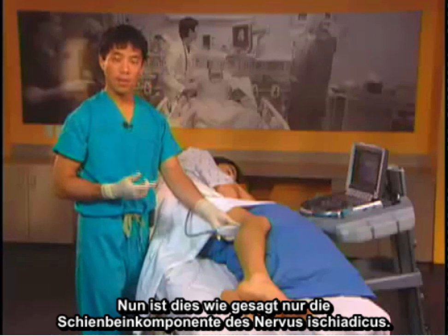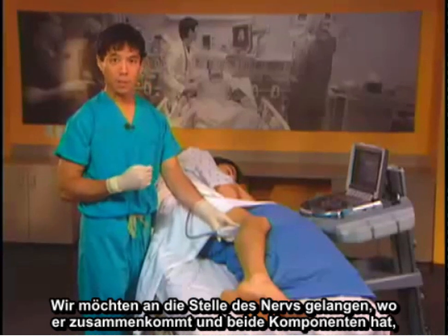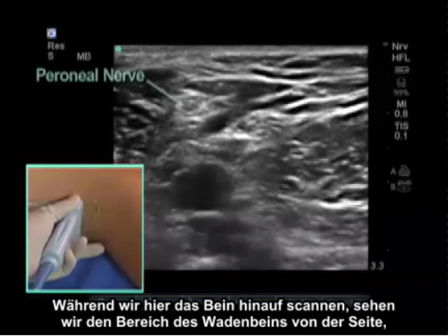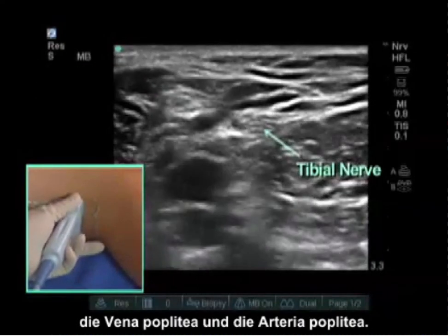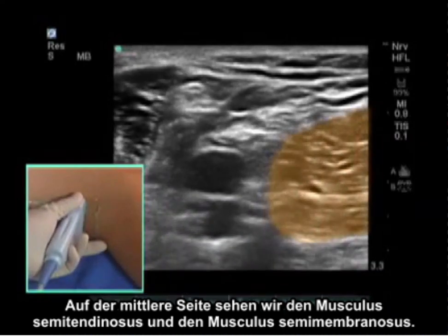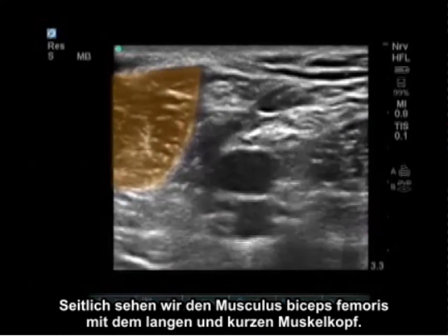This is only the tibial component of the sciatic nerve. We want to get the nerve where it comes together and has both components — the peroneal and the tibial component. As we scan up the leg we now see the peroneal component laterally, the tibial component medially, the popliteal vein, and popliteal artery. On the medial side we see the semitendinosus and semimembranosus muscles. On the lateral side we see the biceps femoris, long and short heads.